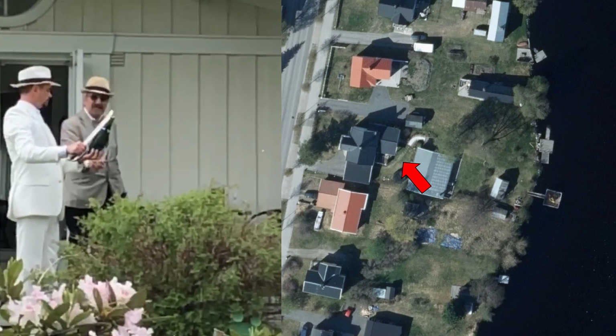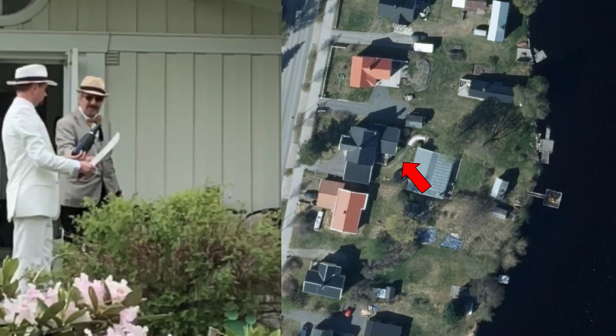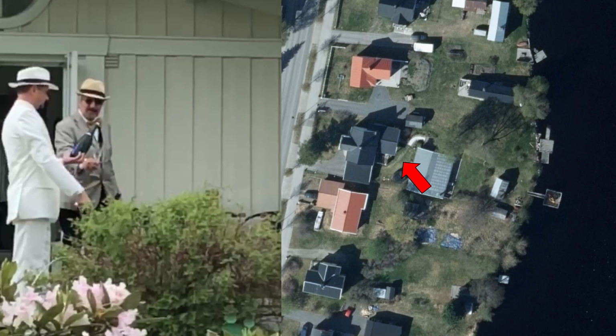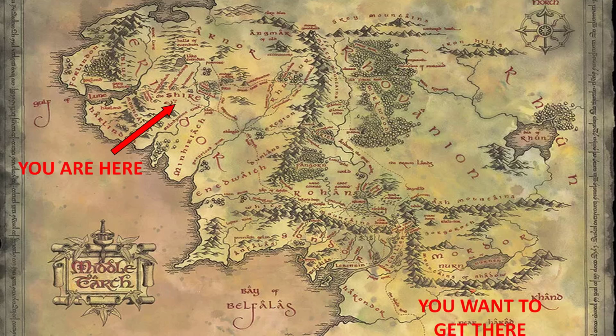DBS is an art and not always an exact science. Hence, even if you have stimulated exactly what you believe to be the target based on the visual model and real images, you might still have a poor effect or unexpected side effects. Programming is based on clinical experience, and there are currently no maps that will tell us exactly where and how to stimulate. It is not possible to base programming just on the model or MRI images, but visual models can point in a general direction and narrow down the options.